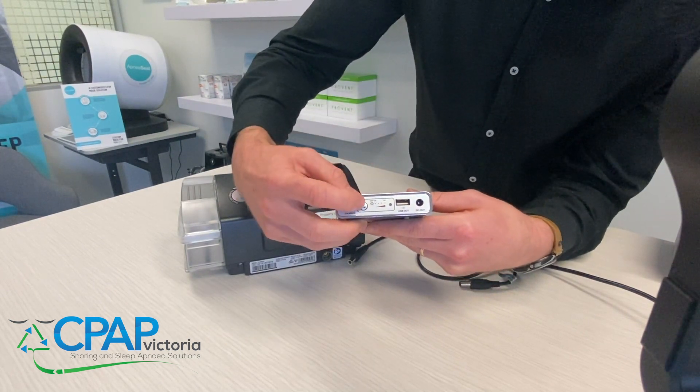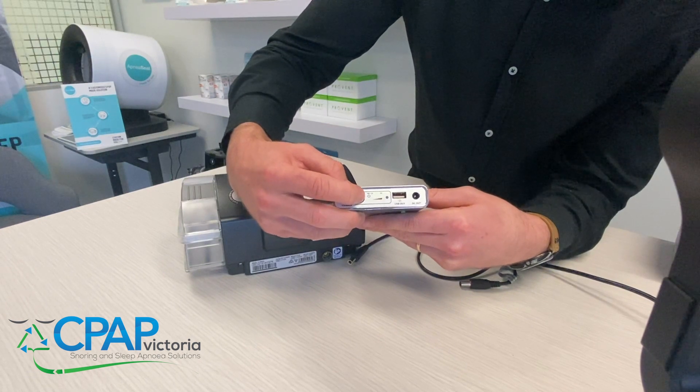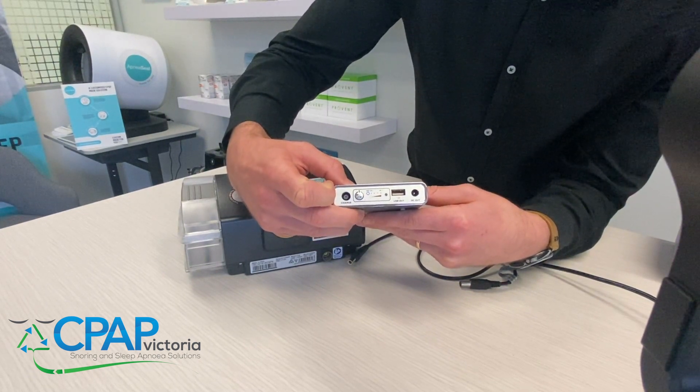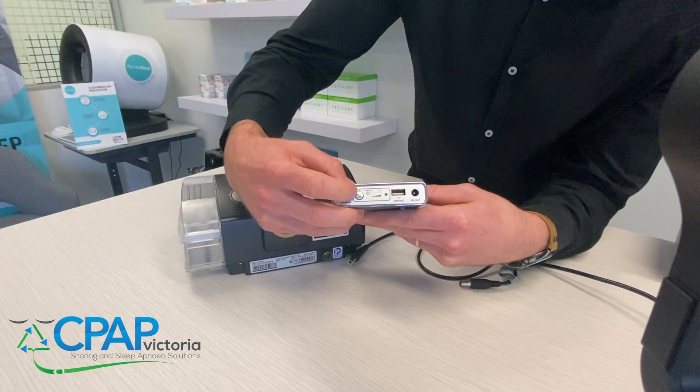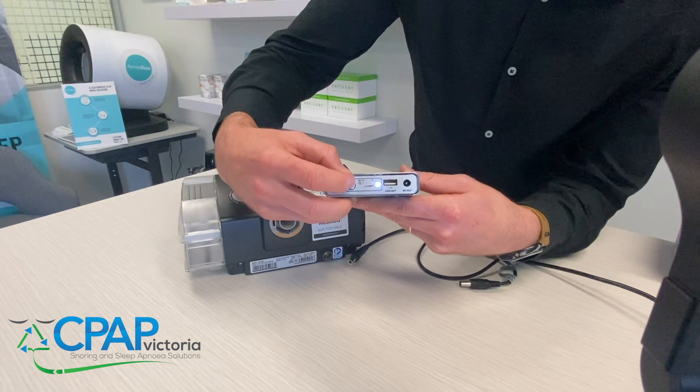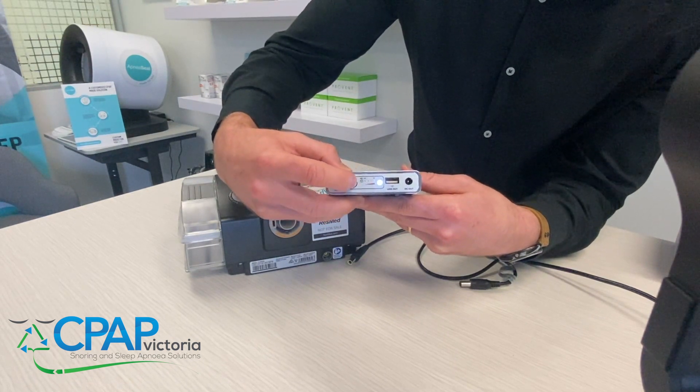You've also got a little button here just next to the charging port — you push it once and it'll illustrate how much charge you've got left on the battery. The other cool feature is you push and hold it and a little LED light will turn on, so you can use this as a torch in the middle of the night if you need to.